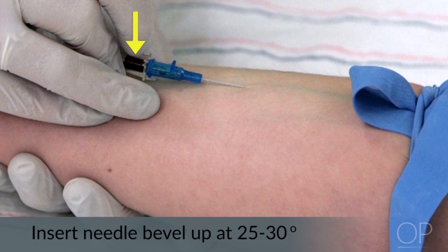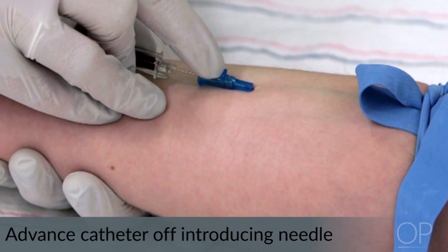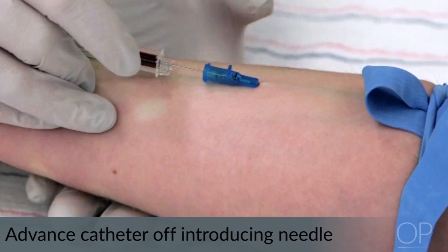Once flashback is visualized, advance the catheter slightly and then decrease the angle of the catheter to be more parallel with the skin. Carefully advance the catheter off the introducing needle by simultaneously stabilizing the needle and sliding the catheter completely under the skin.